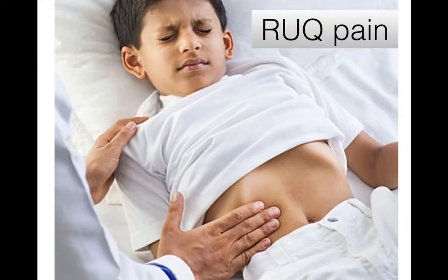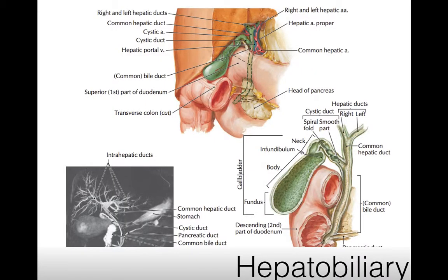The other situation is right upper quadrant pain, to find out whether there is any cause. Normally, a lesion inside the liver should not cause any pain unless it is expanded or has ruptured. So the main focus should be on the biliary system. That's the main goal of the ultrasound.